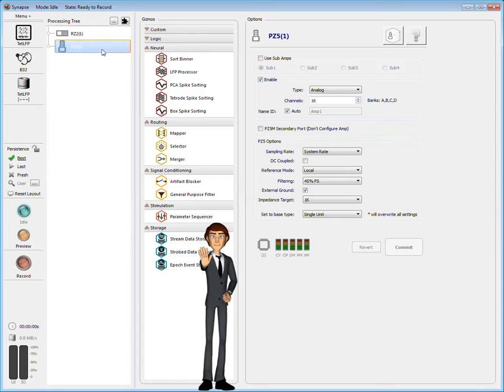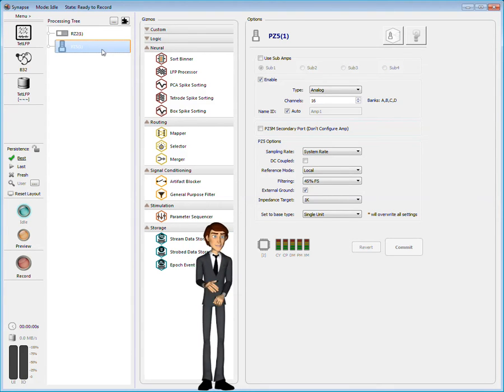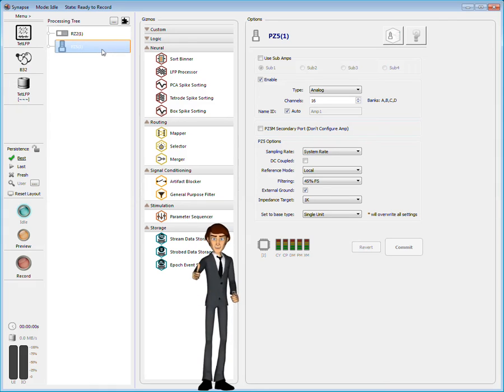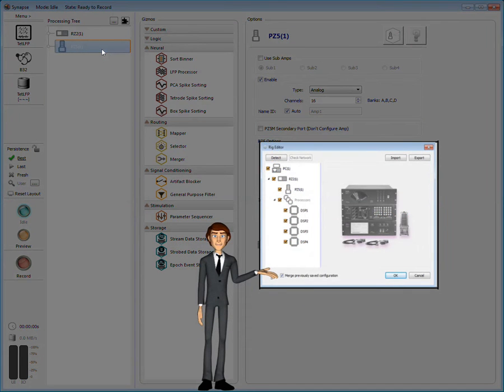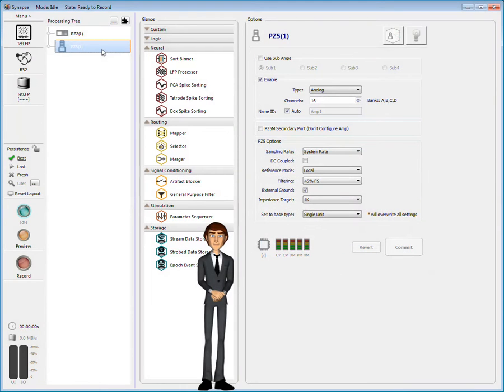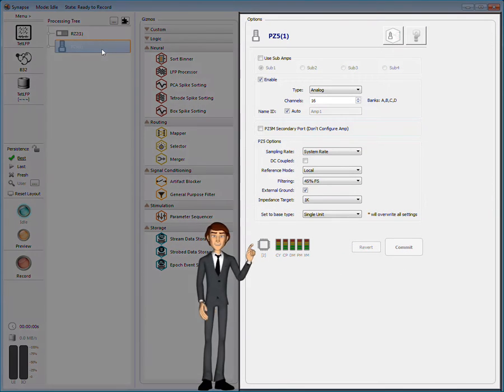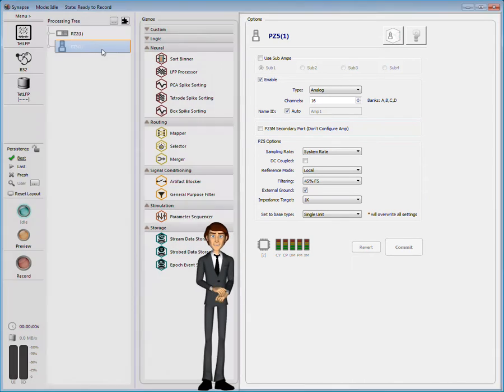But wait. In another demo, you learned that hardware is configured in the rig. That's true. The rig stores universal information about your hardware system used by all experiments. Options modified here are saved with this experiment but won't be carried over to other experiments.